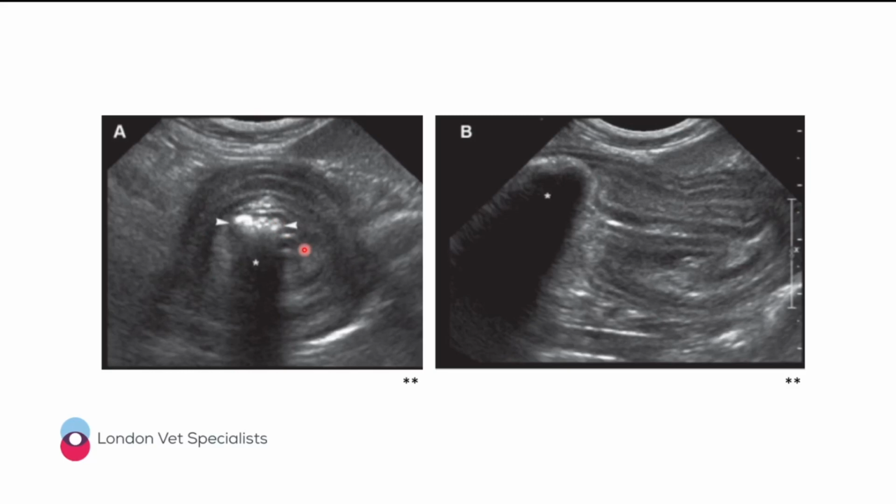So that's a linear foreign body that has an intussusception associated with it. This is how it looked in short axis, and this is how it looked in long axis. In long axis, it's pretty difficult to make any sense of what's going on here, other than there's this shadowing structure in the lumen, and then a whole bunch of small intestine and small intestinal wall layering that really shouldn't be there, interspersed by layers of mesenteric fat.